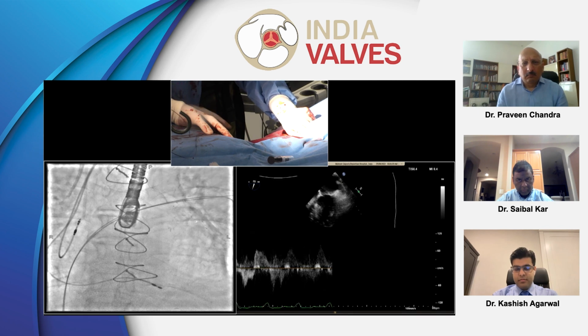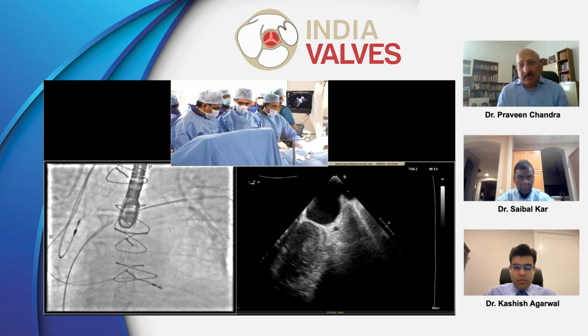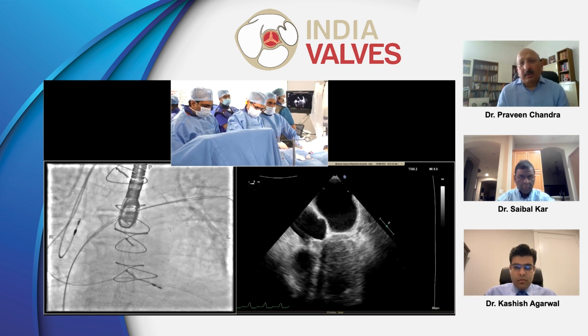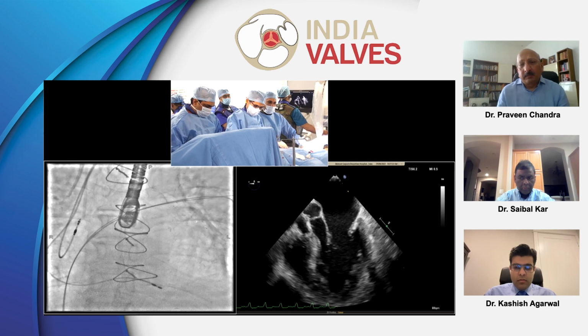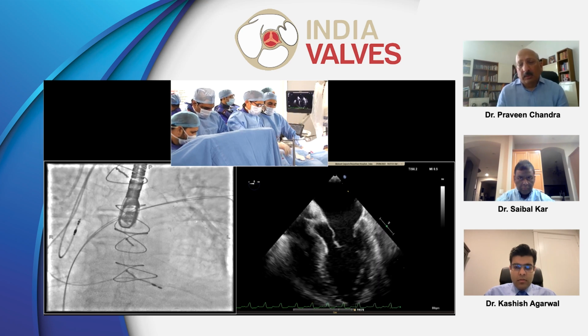So the clip which we have selected for this patient, as we discussed, is an XTW clip. Sometimes these patients start developing a gradient, so that is why we have to be careful. Yes, and that four is when the patient is under general anesthesia. Three, it was coming to 3 and 4.